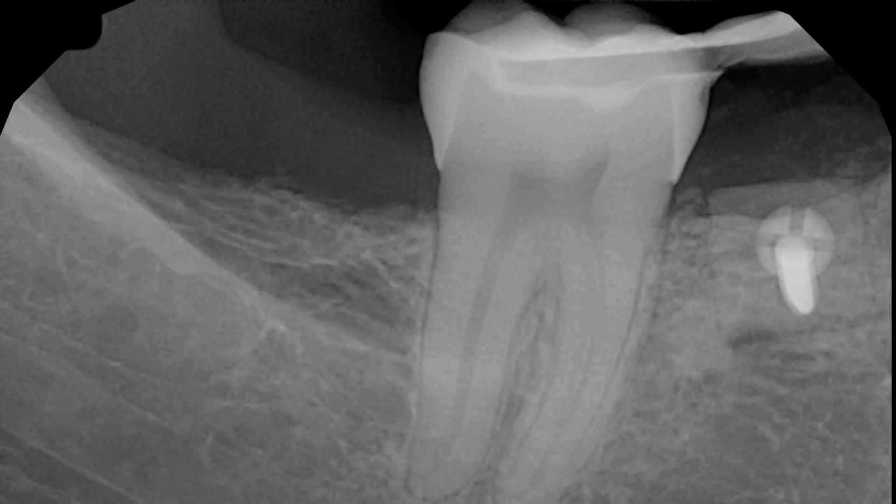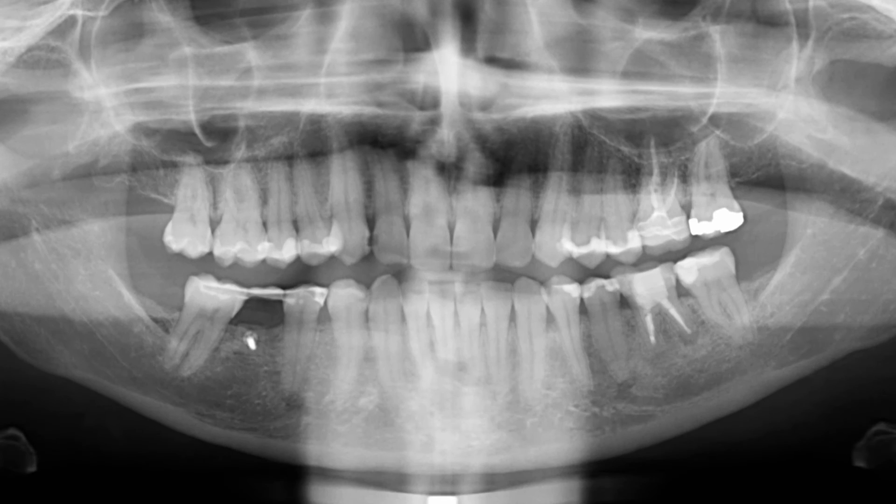From the radiograph and the panoramic radiograph you can see what we've accomplished. We'll go back in about six months to remove the screw. A little trick I like to use is to take the screw out not all the way, but use it to tent and hold the flap open while we go ahead and place the implant. I will update this video on Top Gun when that time comes.